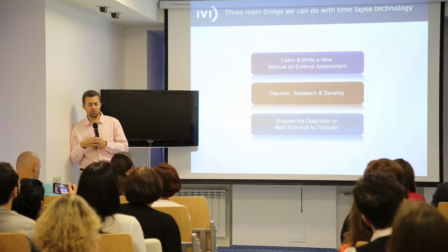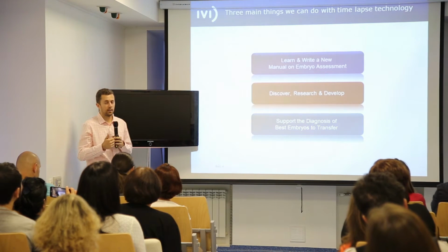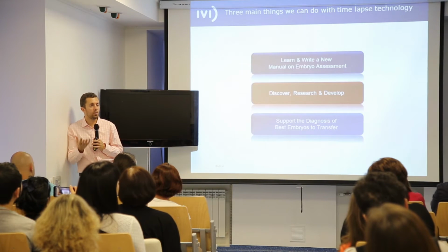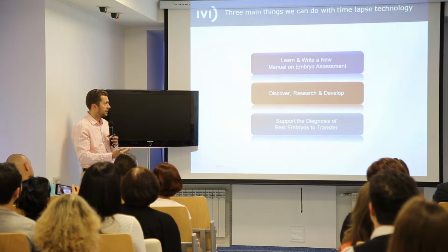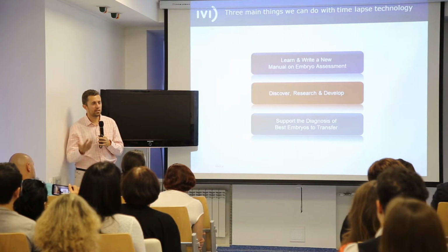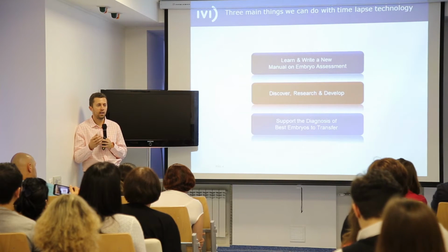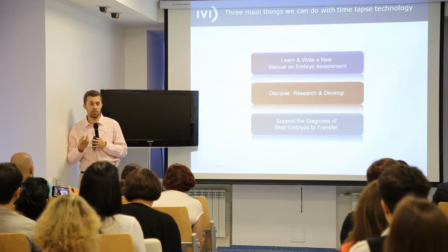So I've tried to summarize the 3 main things that you can do with time-lapse. The first one is to learn a lot as an embryologist and rewrite things about embryology that you learned in the past and that you are now overturning. When I have the chance to discuss with people who have a time-lapse, here, for example, Paulus, every time we talk, we discuss new things that we have seen that we never saw before. So it's amazing what you can learn with this technology, and how you can become a better embryologist.